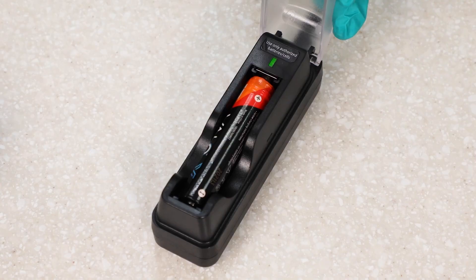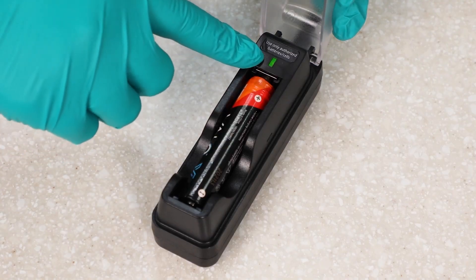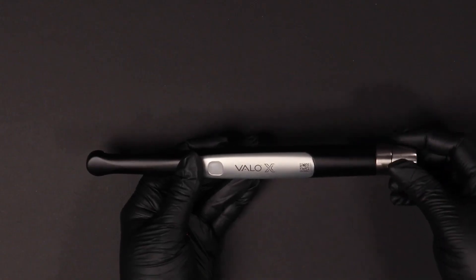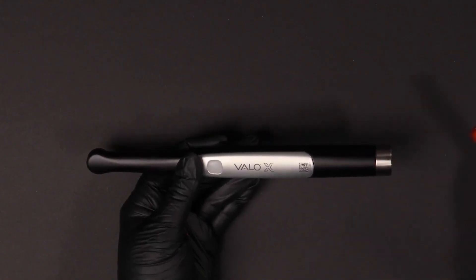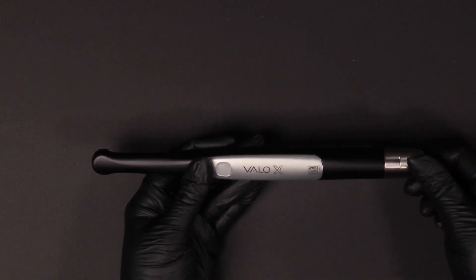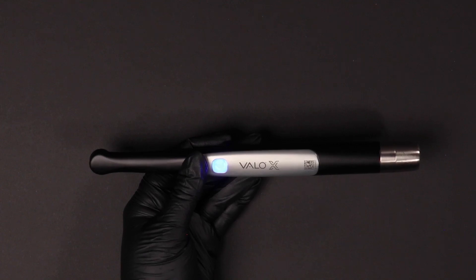To use VeloX Curing Light battery-powered, ensure your battery is fully charged. Twist the cap at the base of the curing light to release the back cap and insert the battery with the positive terminal facing towards the lens. Secure the back cap by turning it clockwise until it stops.